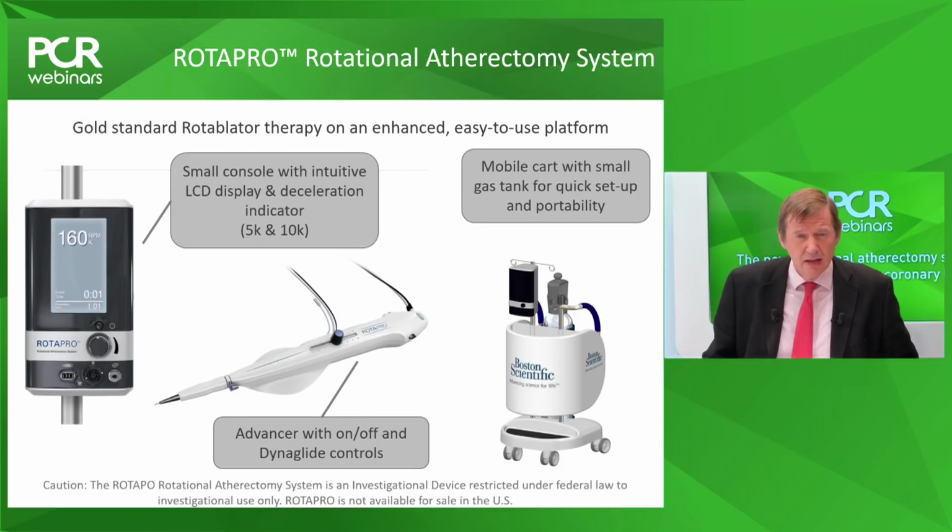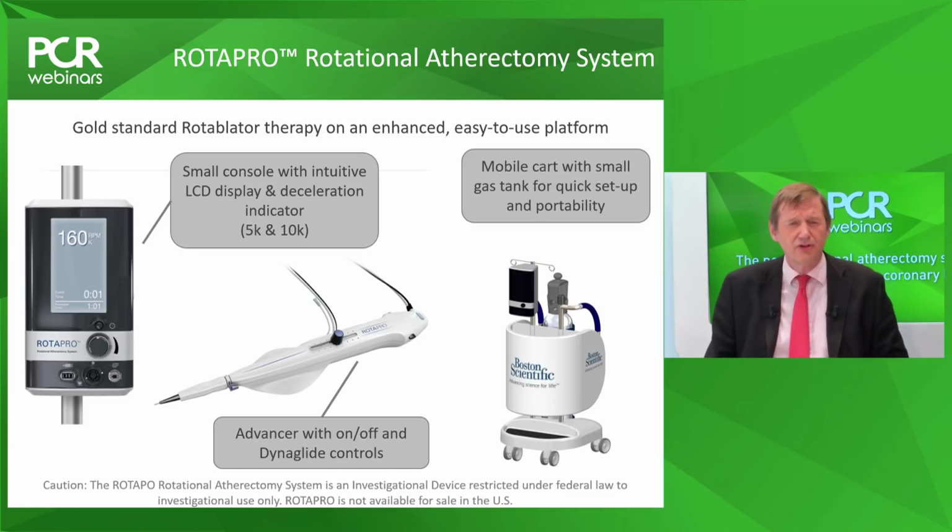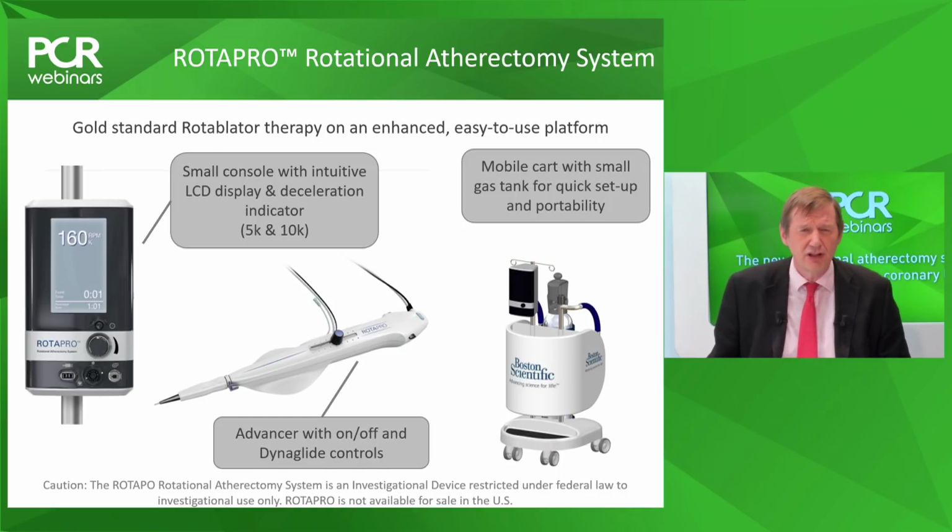The foot pedal's gone. We still have the gas turbine or the wall for whatever it is that delivers your gas. There was some concept about other forms of power, but I think for the time being it's going to remain with the traditional means. So in conclusion, on the slides now you'll see the simple console mechanism that Bruno elegantly described, with a very simplified appearance and a speed button. The new advancer system has 2 very simple switch-on, switch-off mechanisms with inbuilt safety to allow traditional rotational atherectomy.